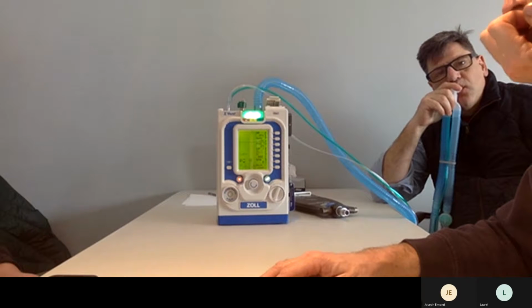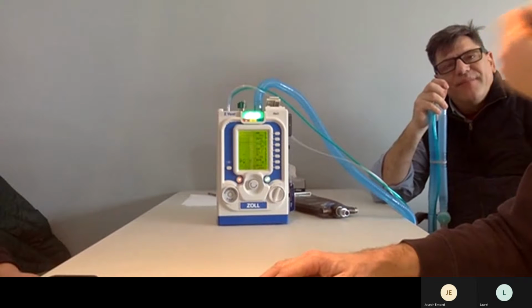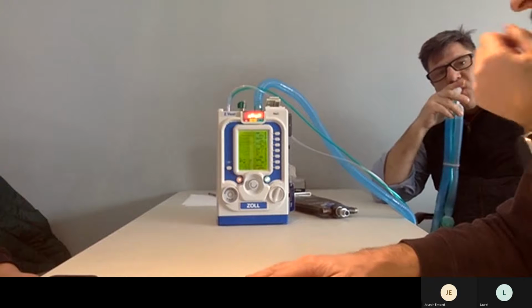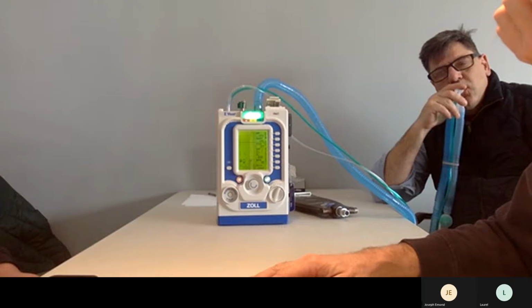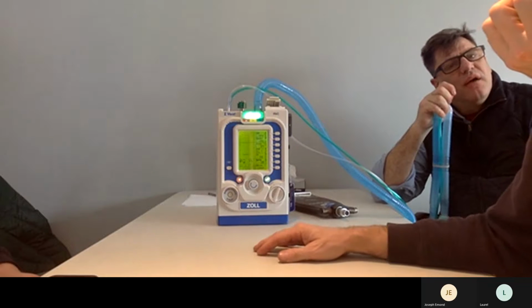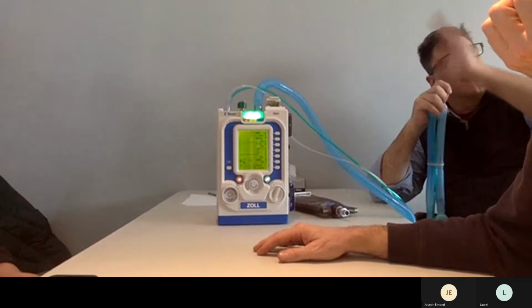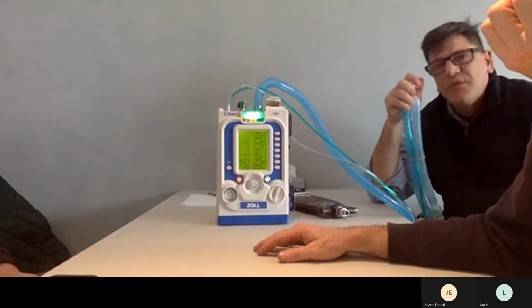I like this much better than the actual mask we normally use. Those little things are great for mild CHF, but it's just a glorified non-rebreather. I wonder if the volumes are blowing up, by the way. And they should go down. My volume should bounce back and forth between inhalation and exhalation.